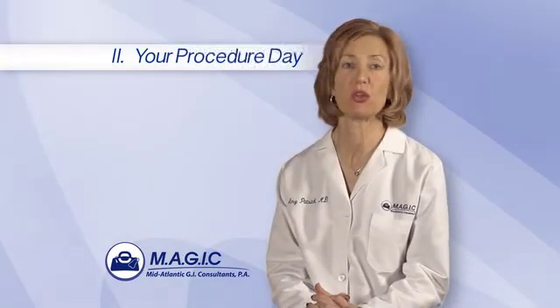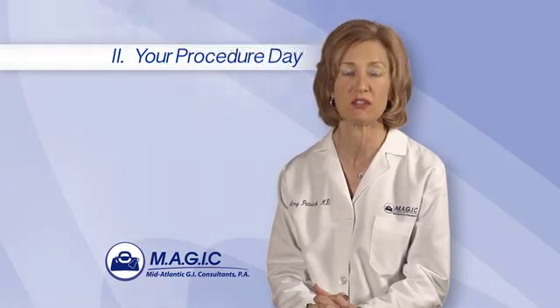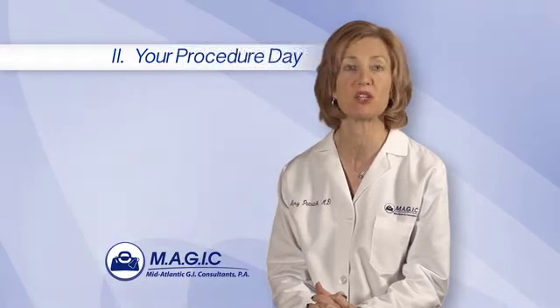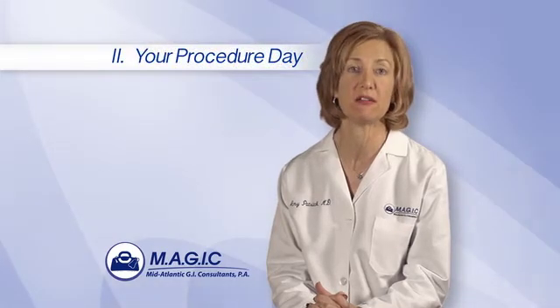Upon your arrival at the colonoscopy center, a nurse will ask you some brief questions about your medical history. Then you will change into a patient gown and your clothing and personal items will be secured. The nurse will then place an intravenous line in your arm or hand.